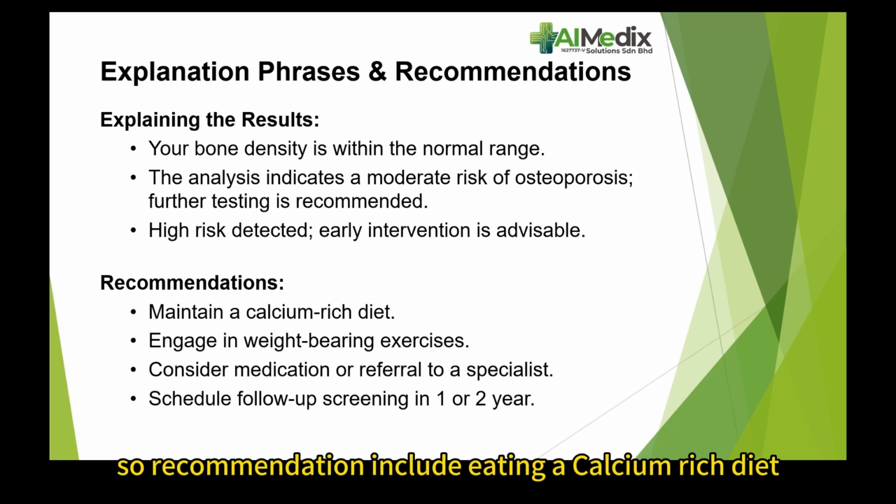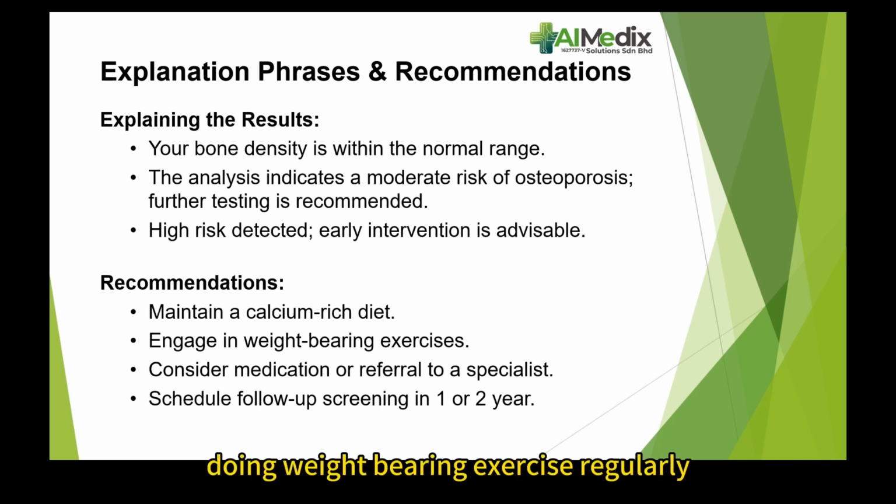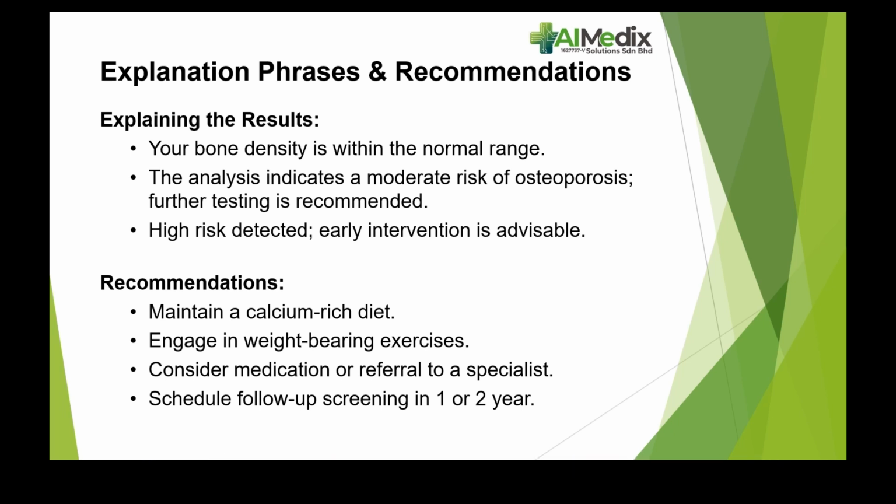So, recommendations include eating a calcium-rich diet, doing weight-bearing exercise regularly, considering medication or a referral to a specialist if needed, and finally scheduling a follow-up screening in 1 or 2 years' time to monitor progress.